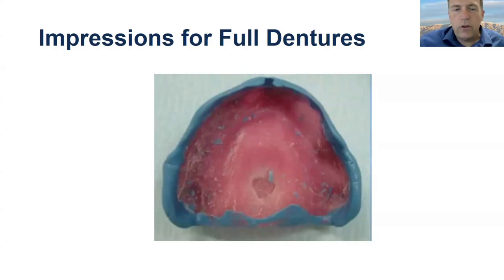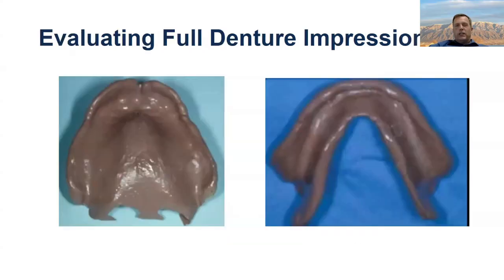All right. So you've done all that. You're looking at your denture impression. Here's my polyether, a blast from the past for some of us. So of course this is a monophase impression material, so there's no lines, but this is a beautiful denture impression. You can see how it has nice borders. We're capturing all the frena, and see how there's texture everywhere. That's one of the things you really want to be looking at, because if you don't have good texture, you probably don't have good adaptation.